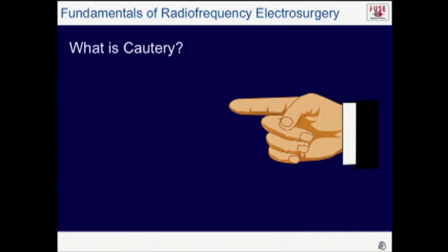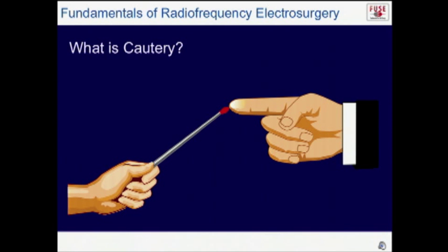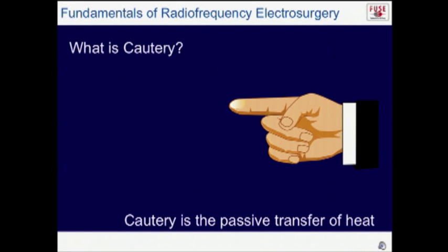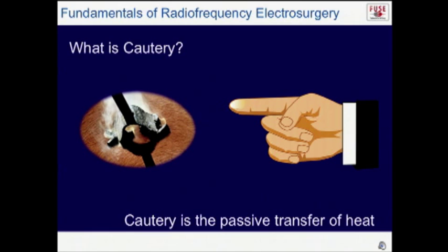So what's cautery? Well, cautery is the passive transfer of heat. So you heat something and you transfer that heat to the tissue. So branding is an example that we know about. That's an example of cautery.